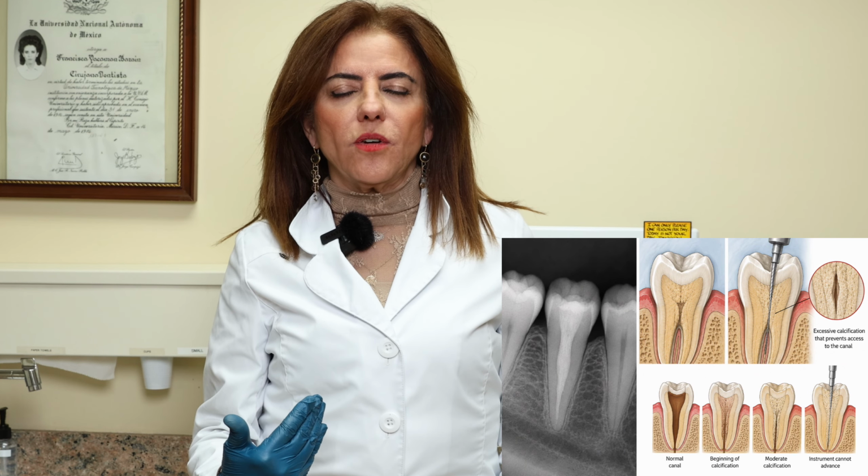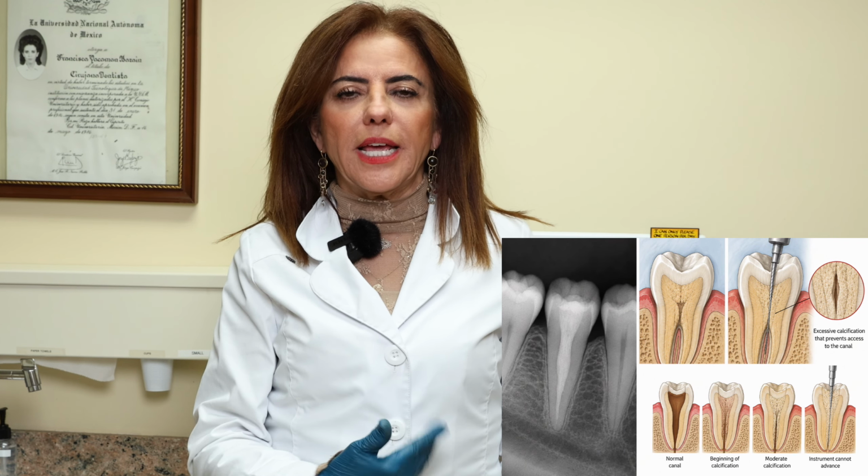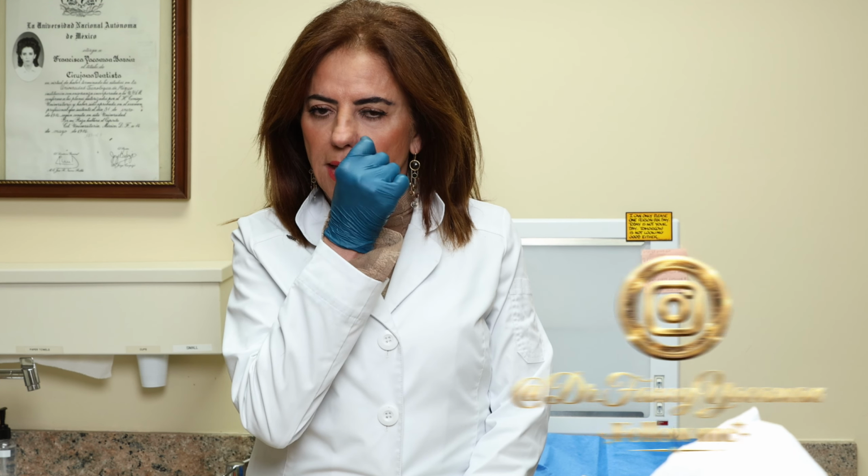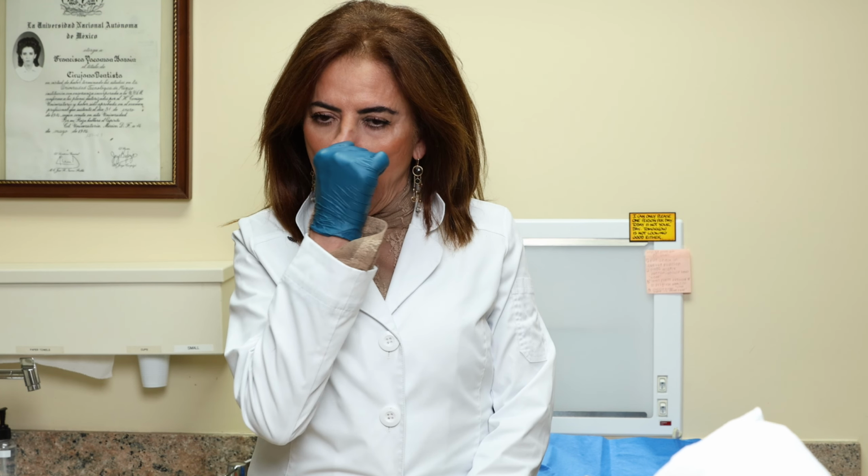My chairman in Mexico, before I came to USC, used to say, breathe, and if you go crazy, take a pill of patience, just to say meditate before you start, because you have to spend an amazing amount of time. At USC, the chairman at that time taught not to spend more than 15 minutes if the canal is calcified, and we go straight to do surgery.